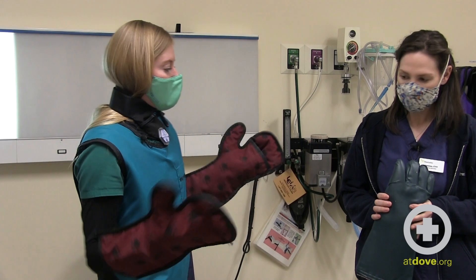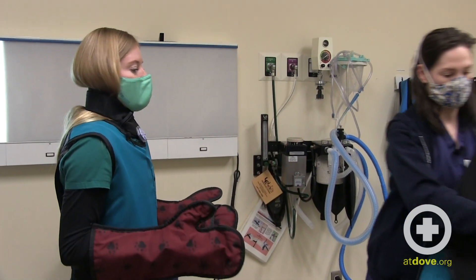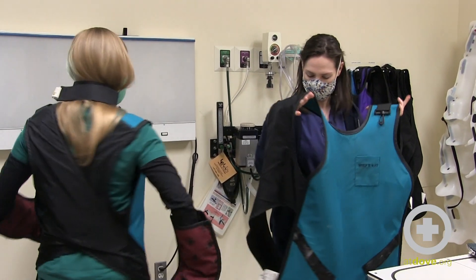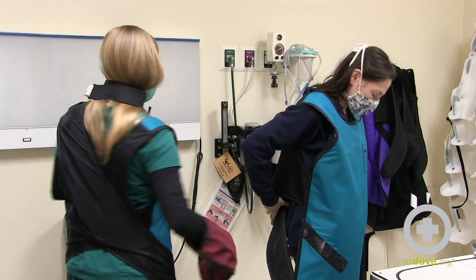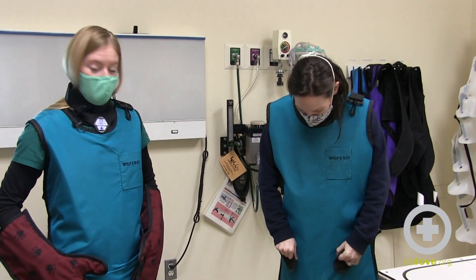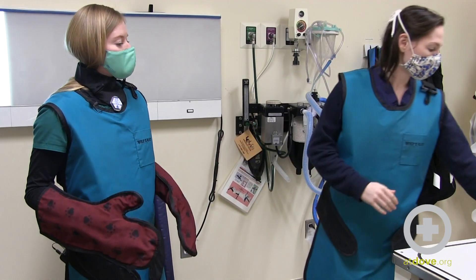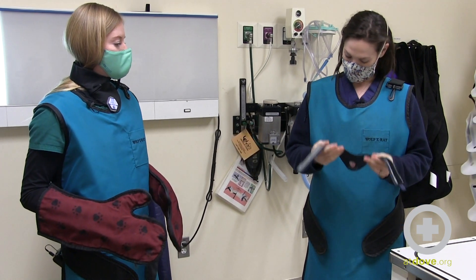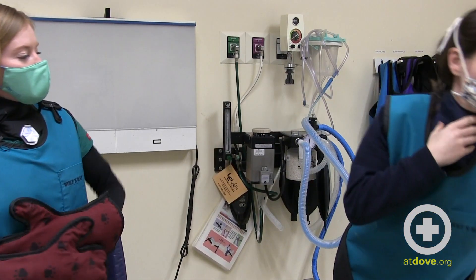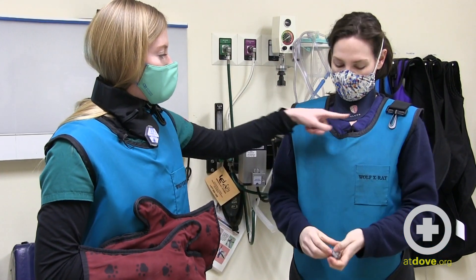First thing we need to do is get our aprons on. The aprons have straps that go around your back and cross behind your back. The ones we have sit down fairly high on the thigh. The next thing is the thyroid shield. There will be a little bit of space between the thyroid shield and the apron — this is pretty normal.